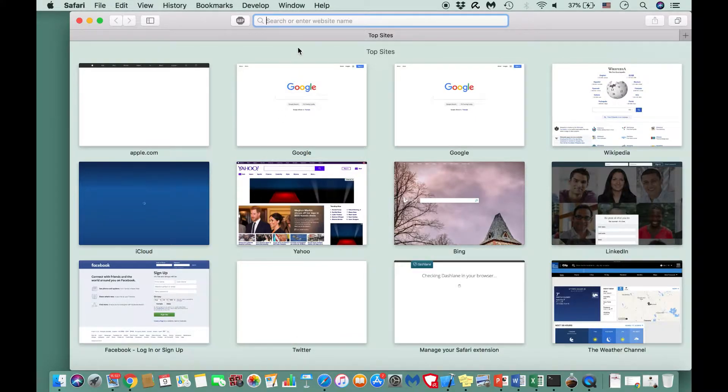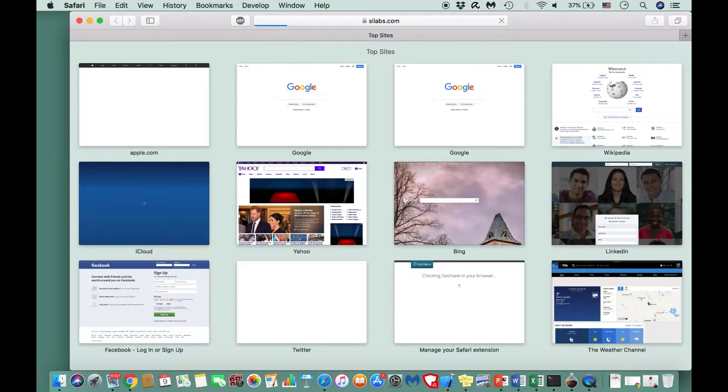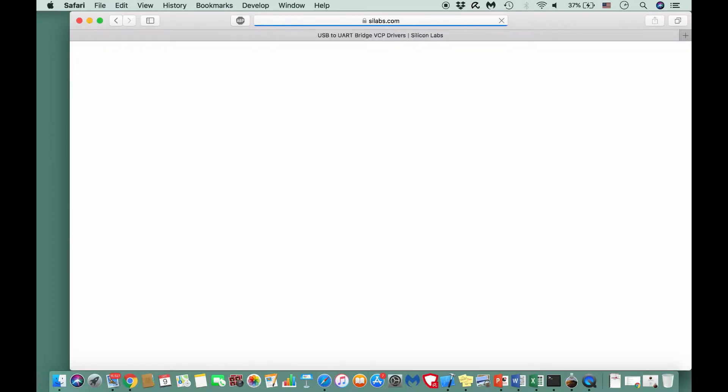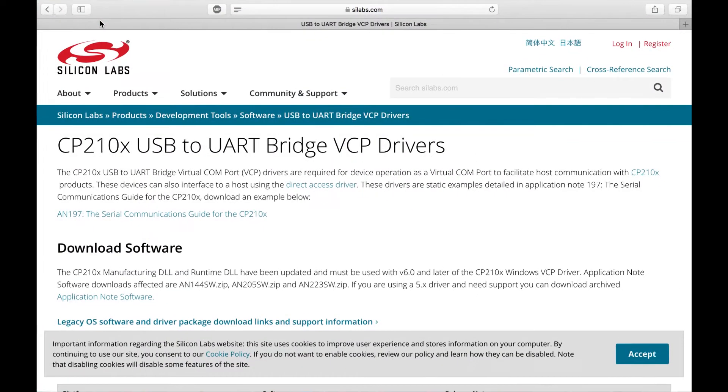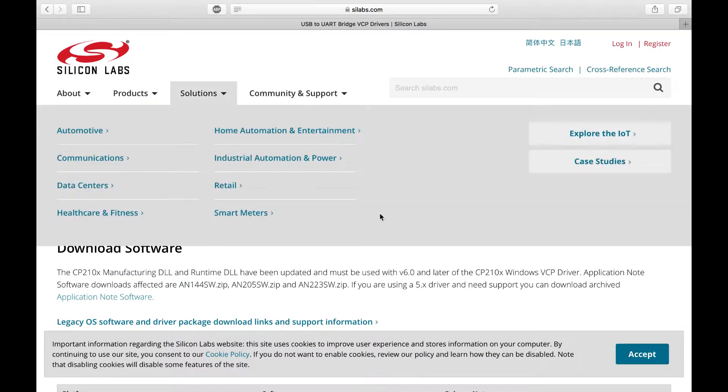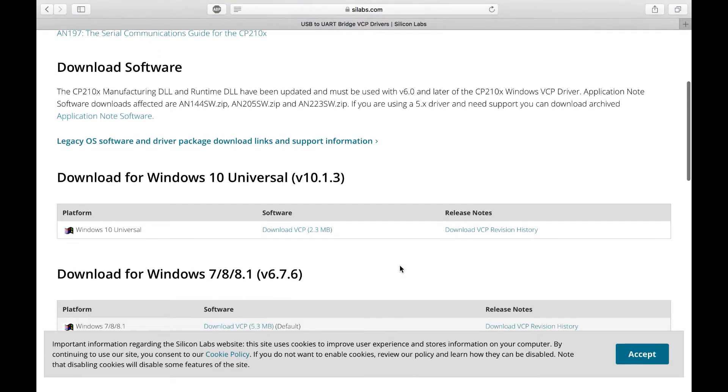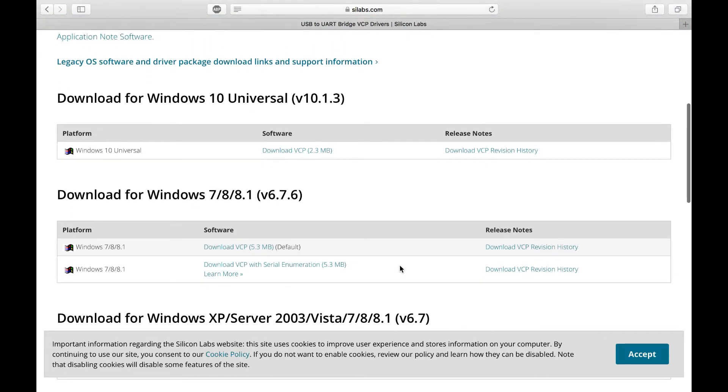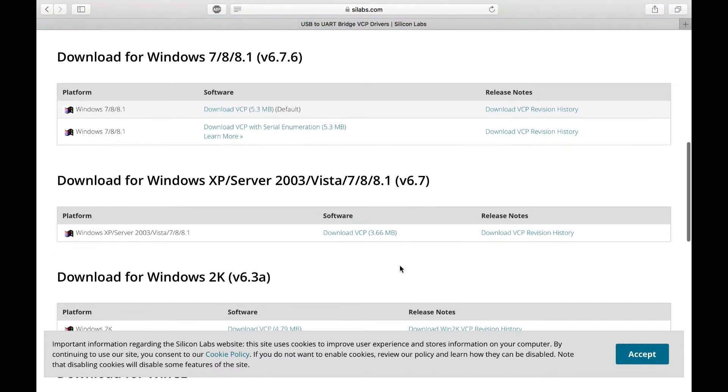Please visit Silicon Labs website. The exact link is provided underneath the video description. Scroll down and find the driver for Mac operated computers and hit download.